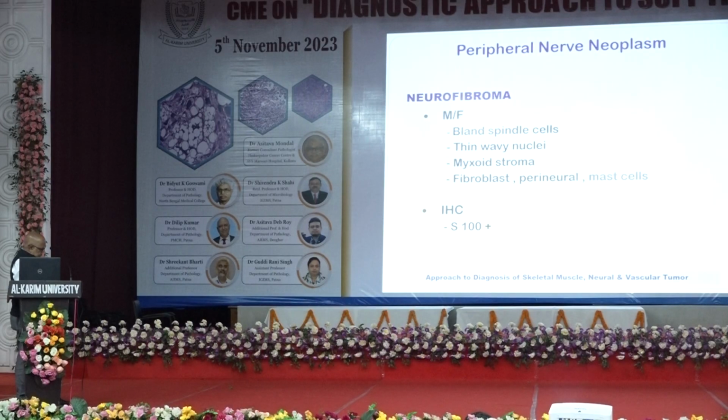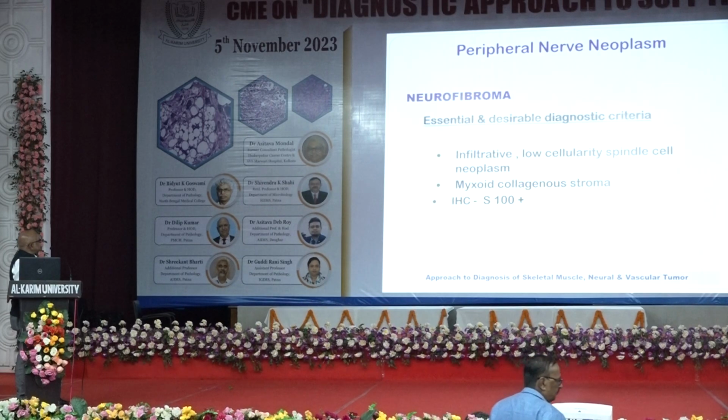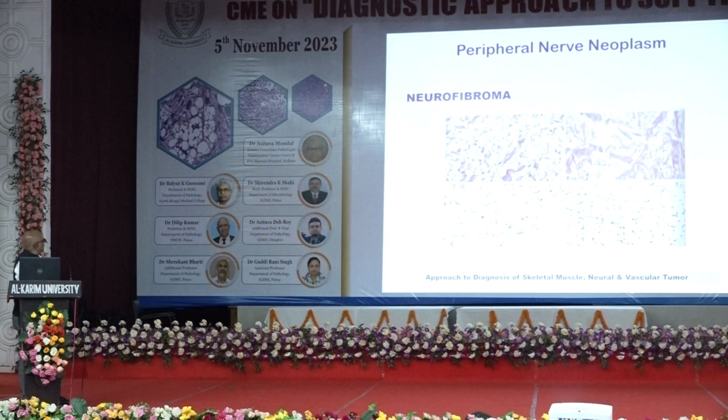If you do IHC, S100 is always positive. So the essential and desirable diagnostic criteria are an infiltrative, low-cellularity spindle cell neoplasm with myxoid collagenous stroma with S100 positivity. Without any mitosis, you can label this as a neurofibroma.